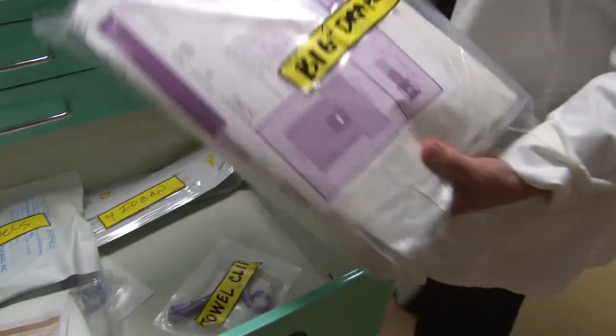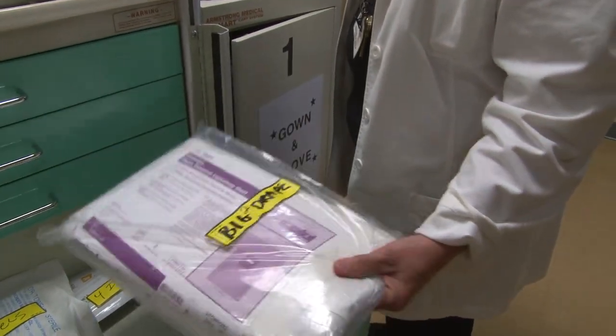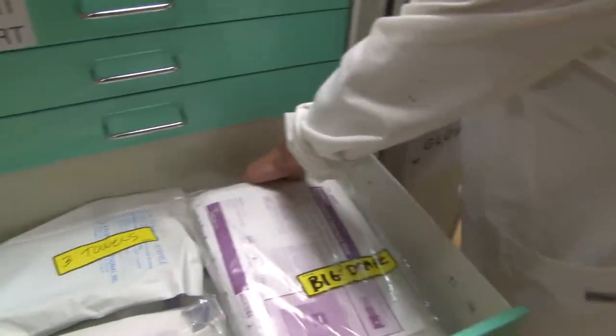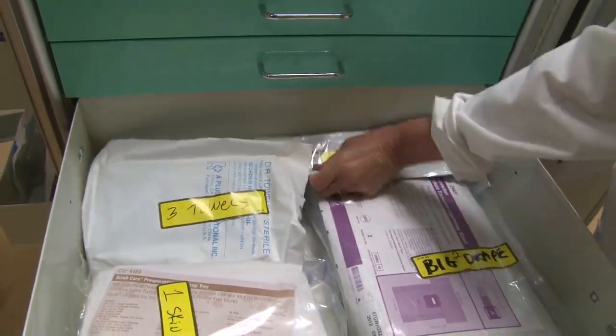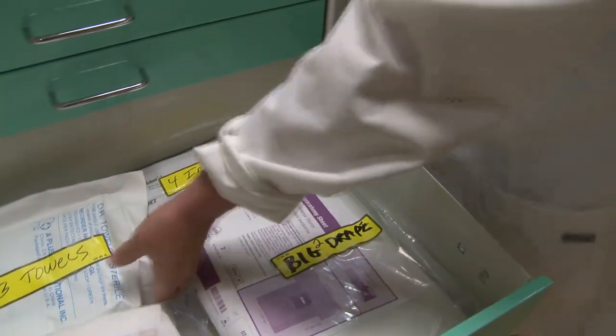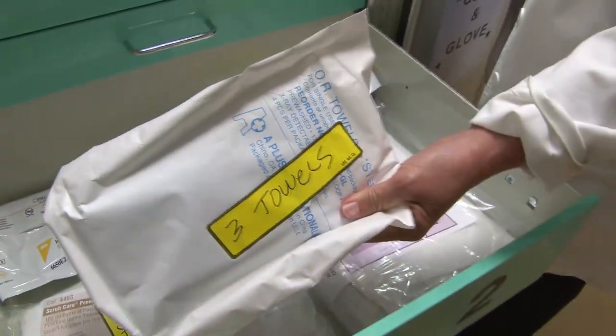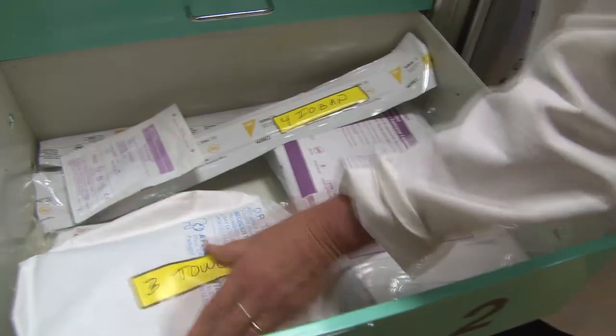Once the skin is prepped, you want to open number two — the big drape — which they will spread out and make the entire bed a sterile field. You may or may not want some Ioban, but it's here if needed. This is a plastic-like cover impregnated with antibiotic that will go over the chest. Open up these towels and throw them on the chest in case he wants them. If he asks for towel clips, those are here too.